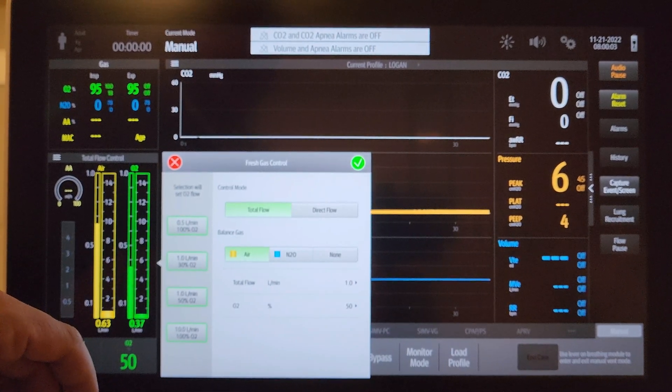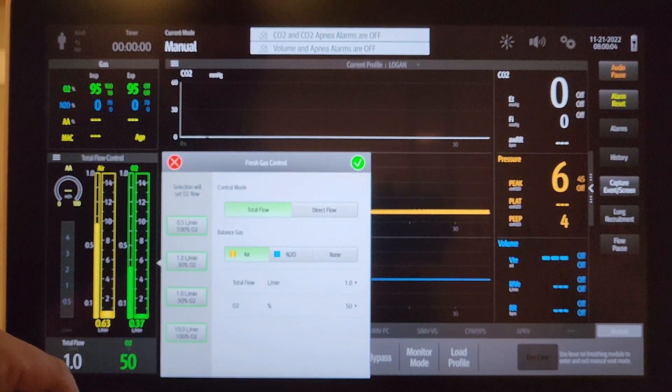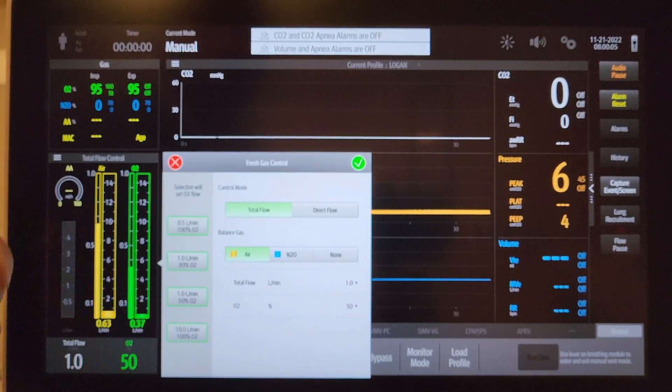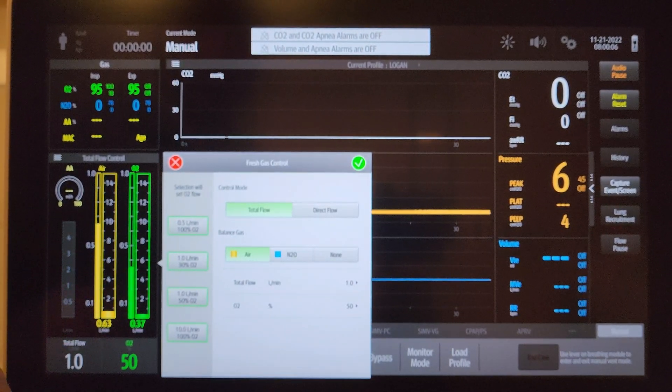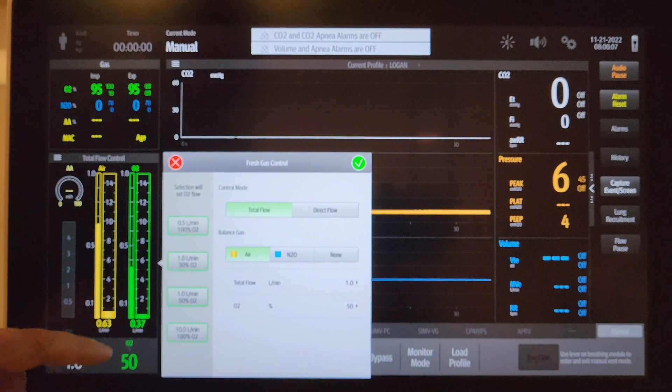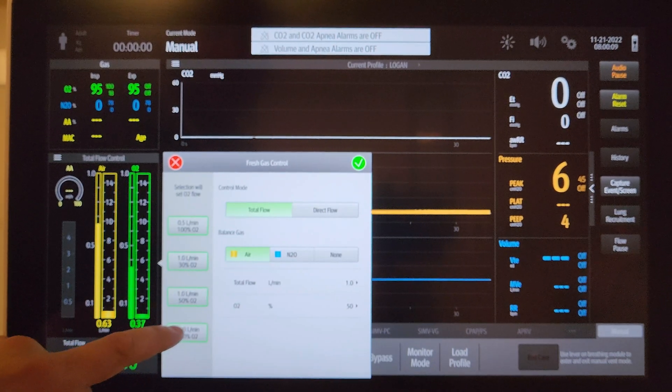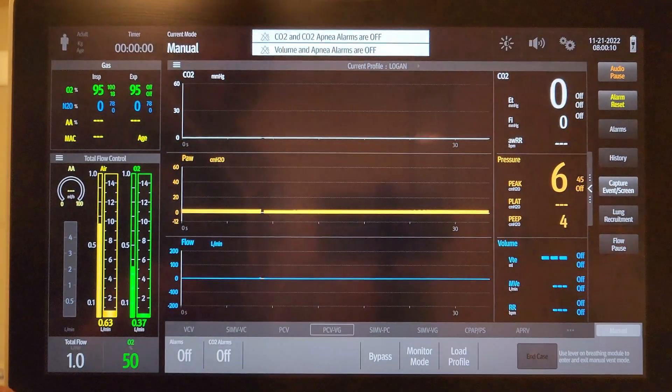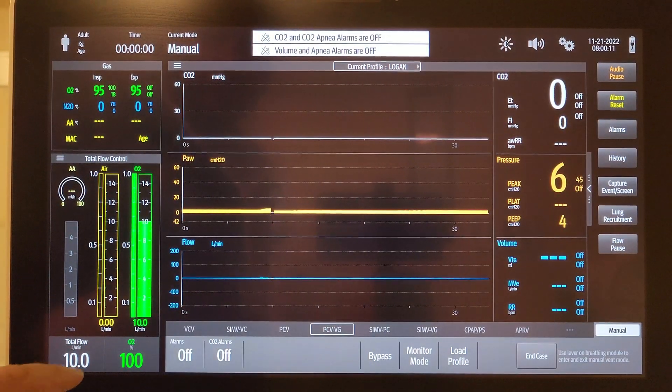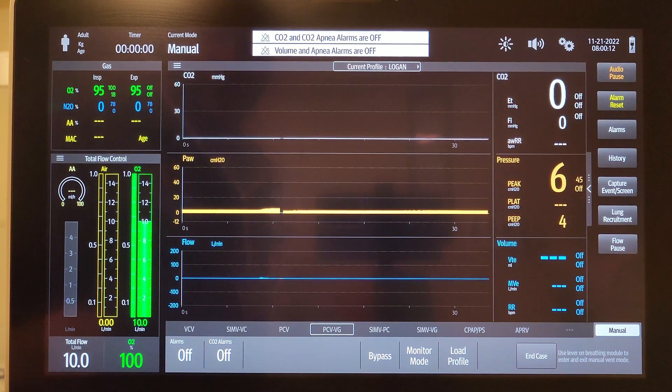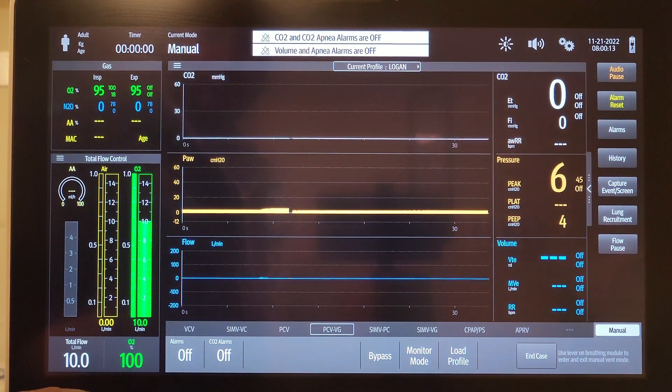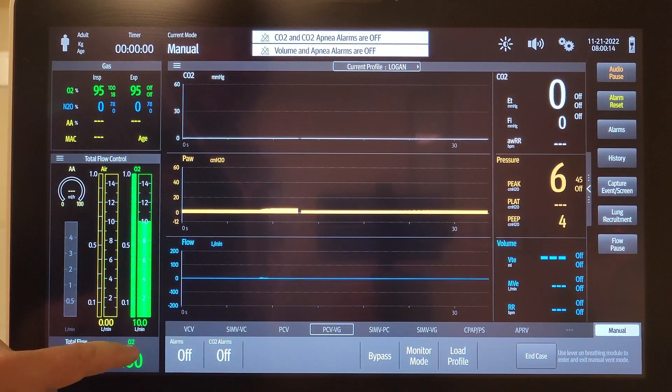Let's say I've got a patient that I want to just start waking up from anesthesia. Instead of going and doing manual things, I can click 10 liters a minute, 100% FiO2, and it goes to that down here.